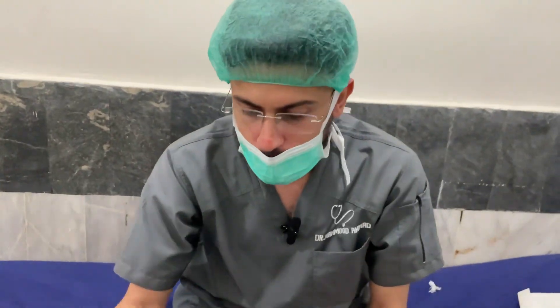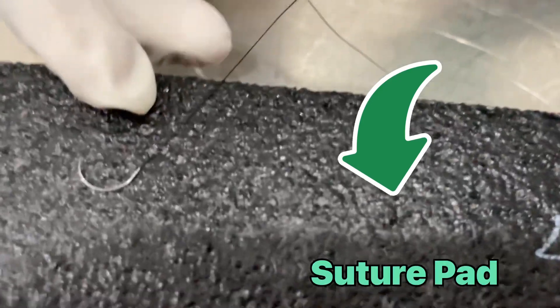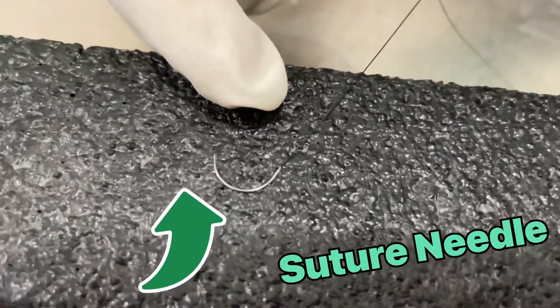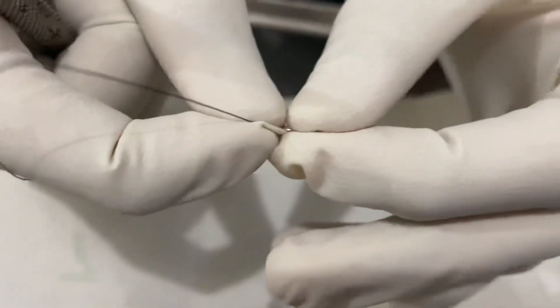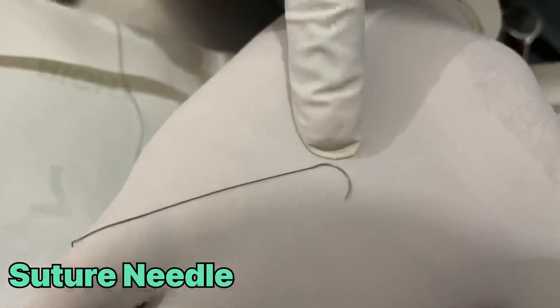This is the suturing pad and this is the suture needle. We will be explaining it in a while. This is the suture needle — you can see it in my hand.